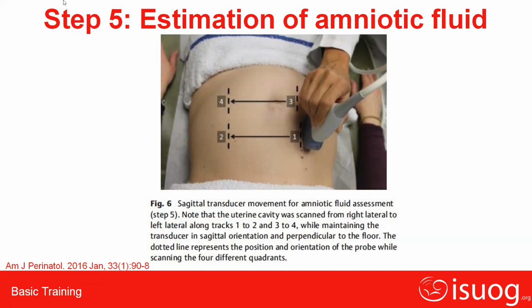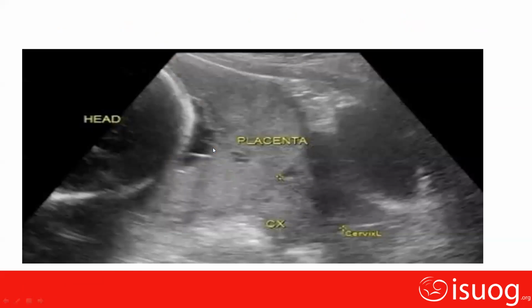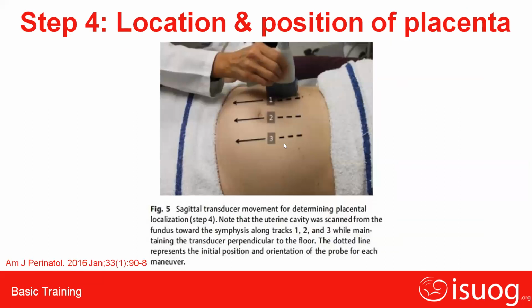So placental localization, again, I have to repeat. Madam, placental localization, I think it's over, or you have not seen it. Yeah, you start right from the beginning. Yes. So localization of the placenta. You were saying that you start from the fundus, very important, downward.